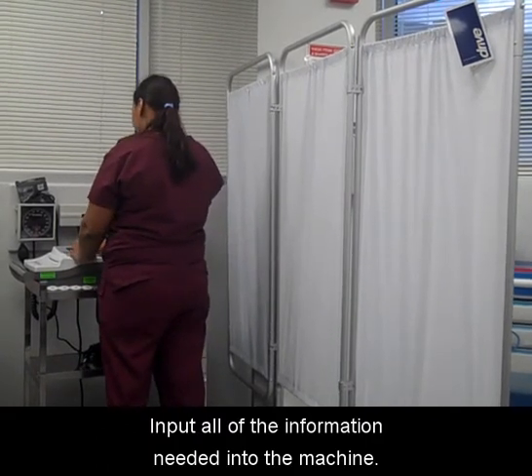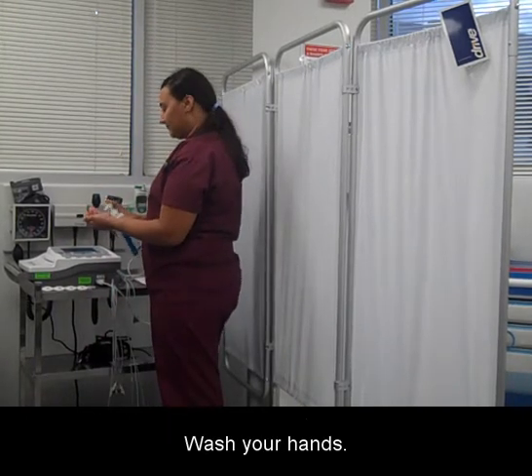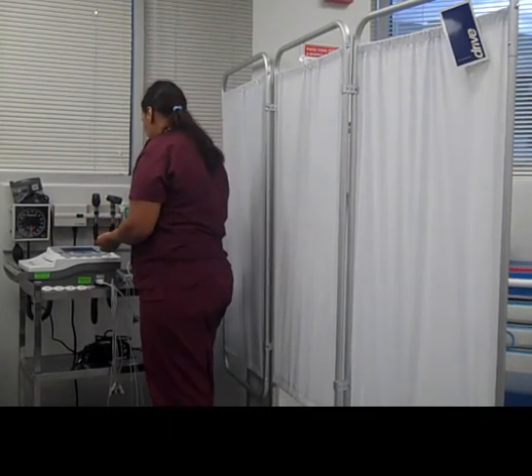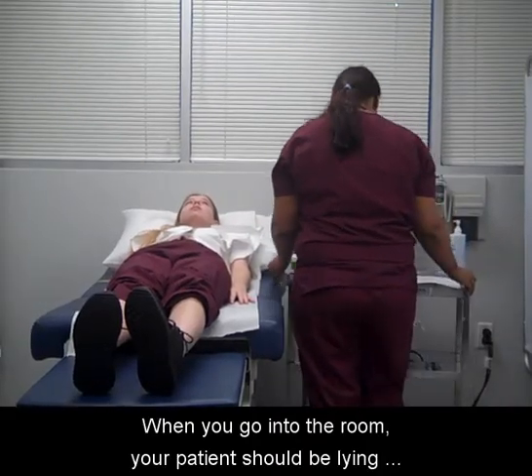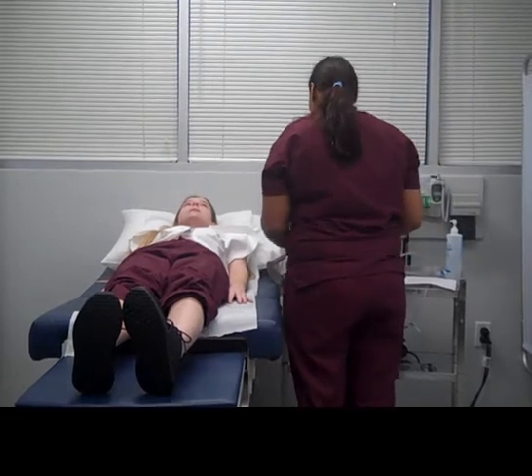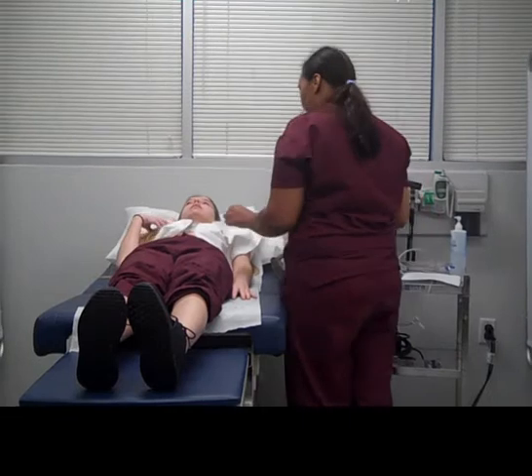Input all of the information needed into the machine. Wash your hands. When you go into the room, your patient should be lying flat on their back. If they're wearing pants, their pant legs should be lifted up.